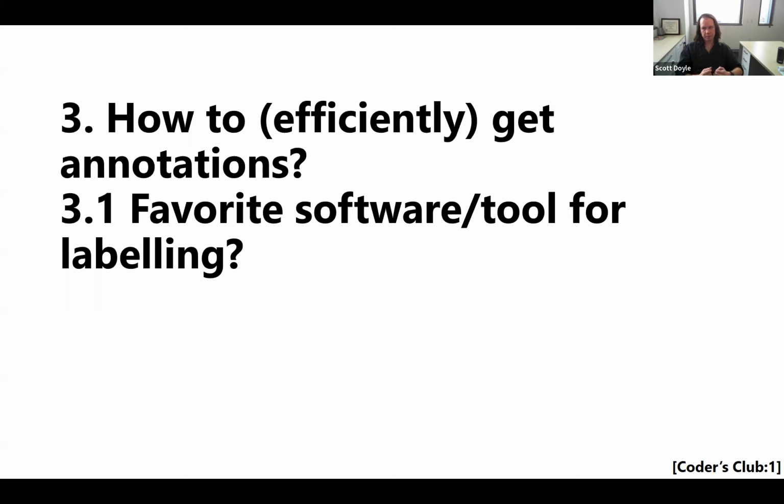A constraint though, right? I don't think you want to have thousands of disparate annotations. Maybe it's an interesting one-off approach. But if you do, that's useful information, because it means that your framing of the problem was based on an incomplete understanding. It means the way that you had that conversation and gave those instructions was based on maybe your own understanding of what a tumor constitutes.